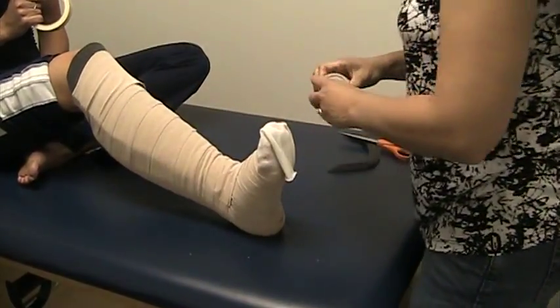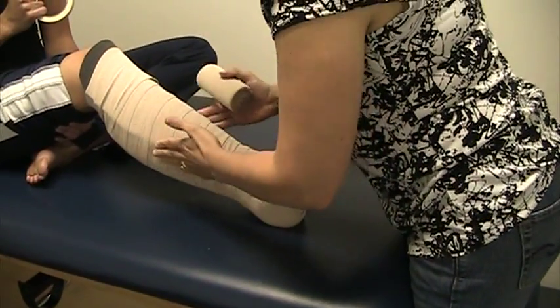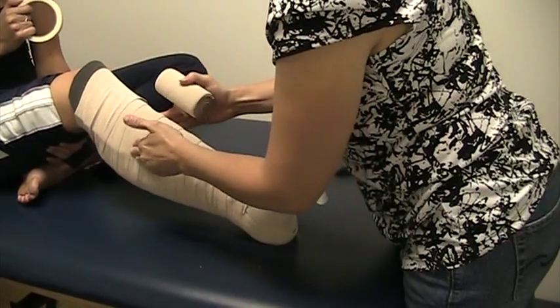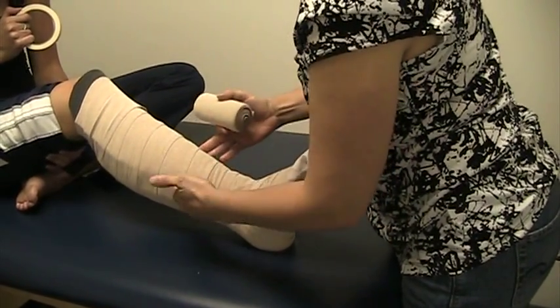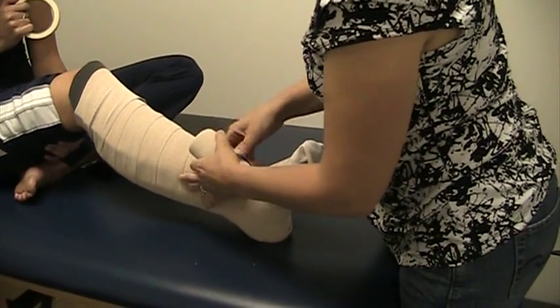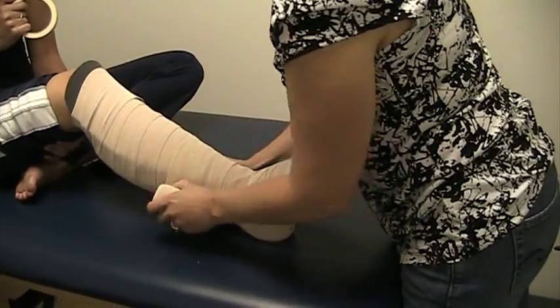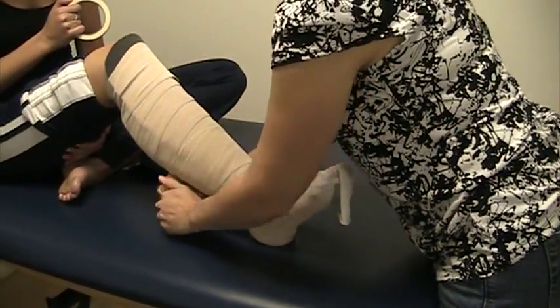To complete the multi-layer bandage, we're going to put an additional ten-centimeter bandage. I'm feeling for the layers of compression down here at the ankle — it's stiff, and so I want to find the soft spot in this bandage. We're going to roll the bandage out in the opposite direction with a half overlap.